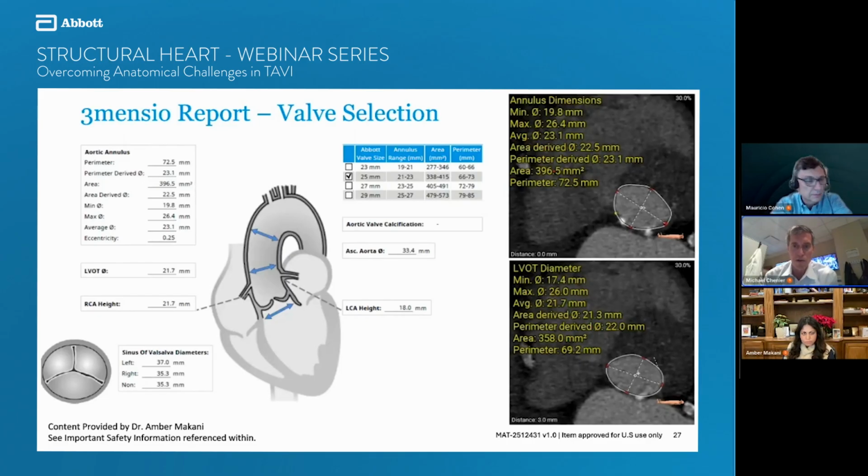And then if it's communicating with the mitral valve also, in the anterior mitral valve leaflet, where you've got these really dense plates of calcium, you're going to crack something along that line when you're dilating with a balloon or putting a TAVR valve in. I get a little bit concerned about that also in terms of injury to the surrounding tissues. But those are usually pretty extreme circumstances, right? Those are kind of obvious things when we see them, and we're a little bit more facile with navigating LVOT calcium that doesn't have those extreme characteristics.